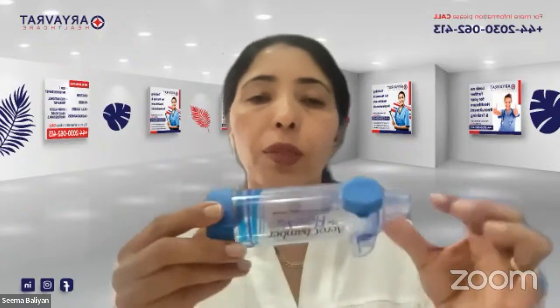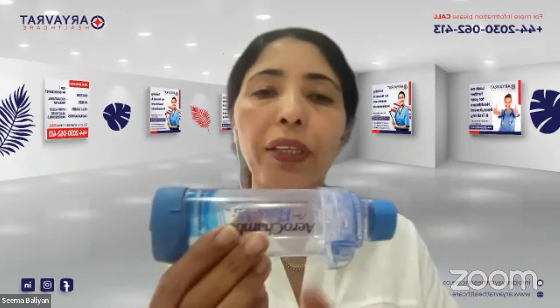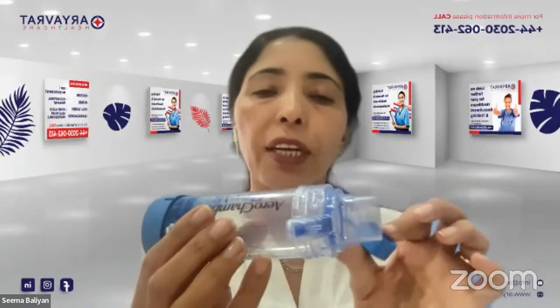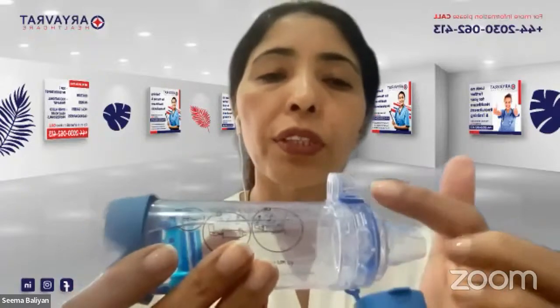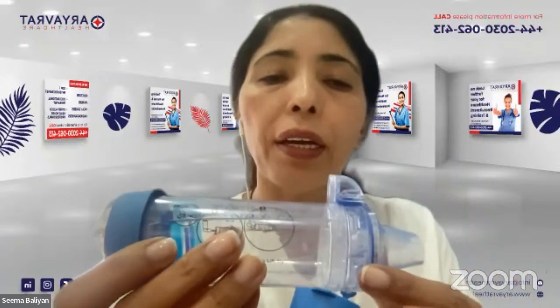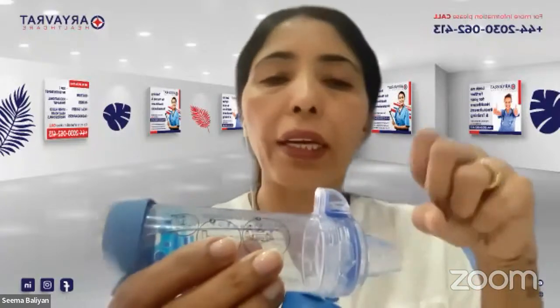Then you are going to look at the spacer. So this is how a spacer will look like. The spacer has a mouthpiece. This is the mouthpiece of the spacer, which is covered with a lid. Then this is the body of the spacer. Between the mouthpiece and the body, you will see this part, which is like a valve. This valve is going to control how you are taking the medicine.